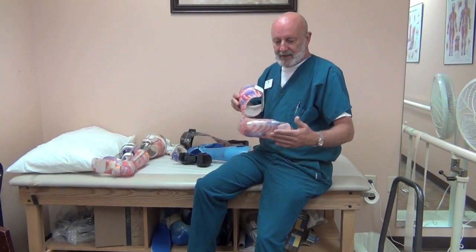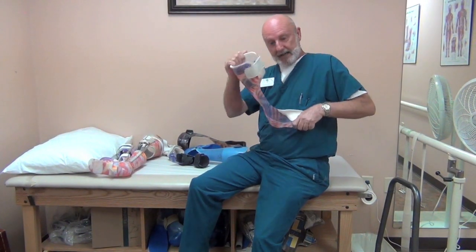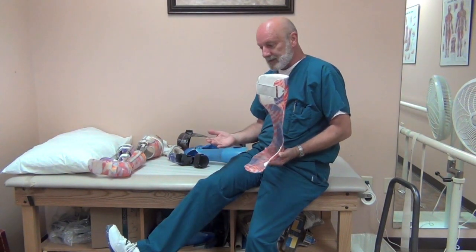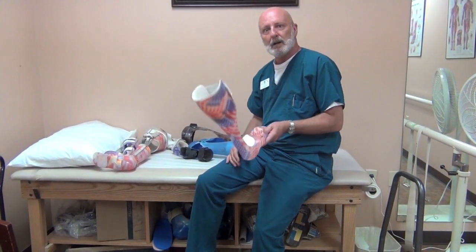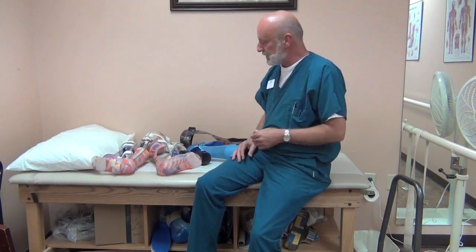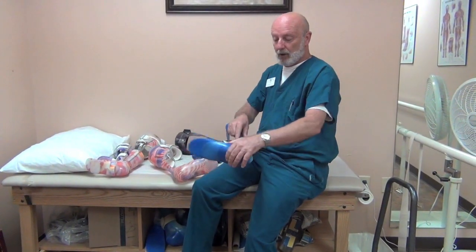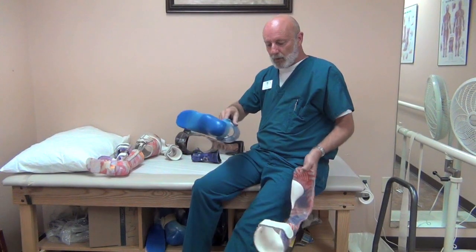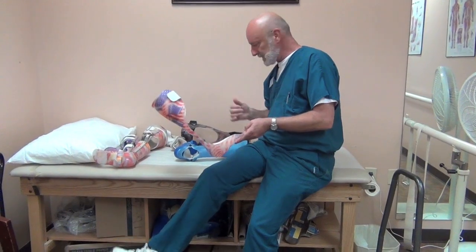Another popular design is the leaf spring. It allows free motion into dorsiflexion and some give at heel strike or plantar flexion, primarily used for weak dorsiflexors and side-to-side stability. This works well for higher-functioning patients — those whose lesion level is lower and paralysis is less. It works on the same lines as a hinged AFO with spring assist, but with less plastic, and is an effective design for weak dorsiflexors.